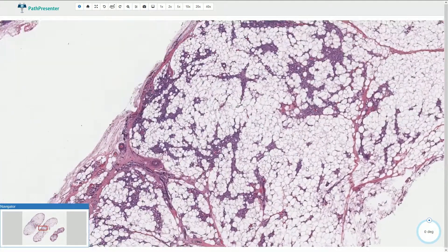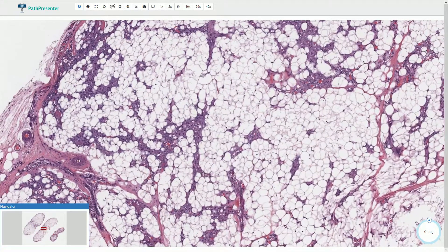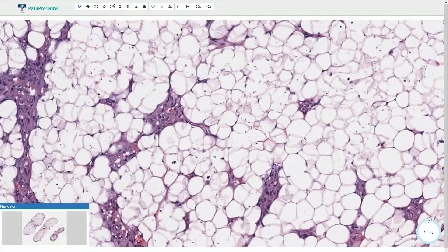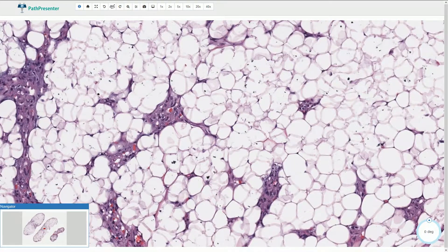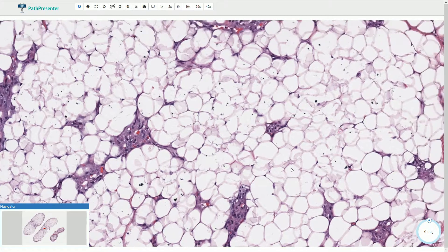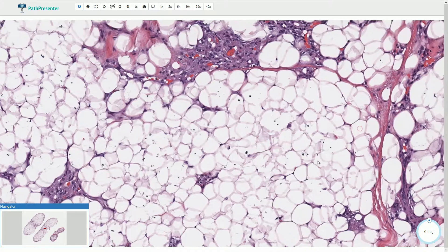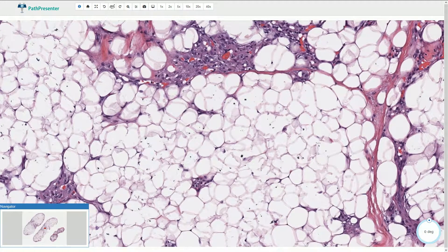The adipose tissue component is composed of uniform, bland-looking adipocytes. There are no lipoblasts and no atypical cells within the fibrous stromal septa.